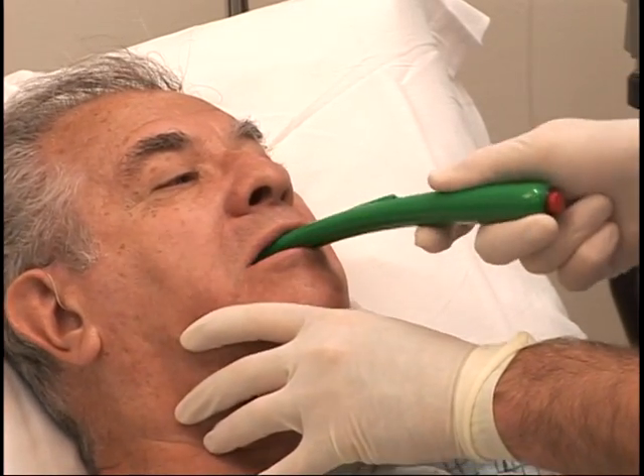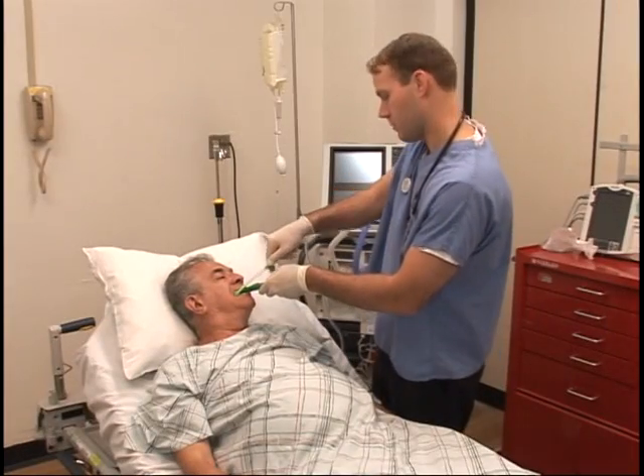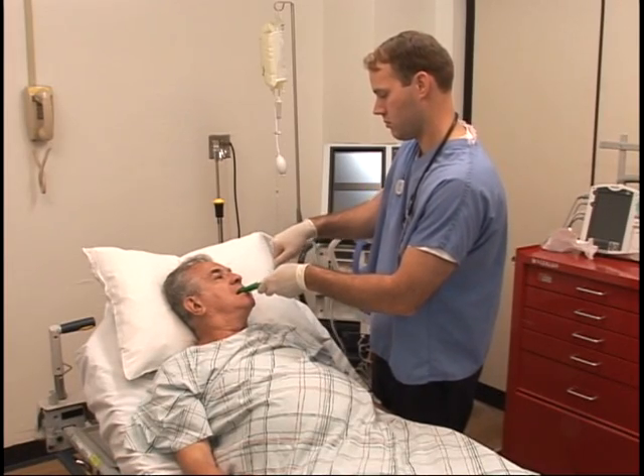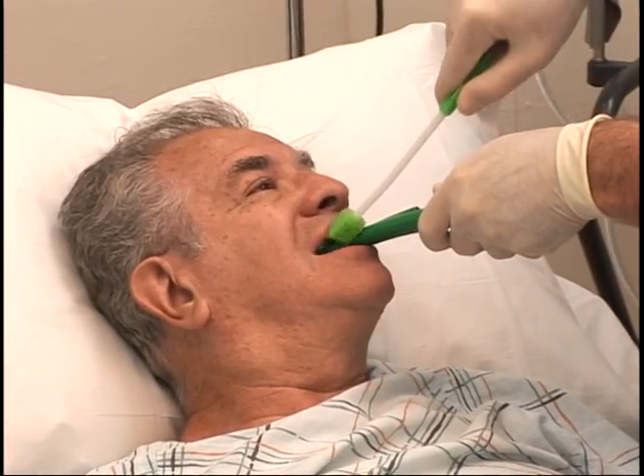Turn on the light for oral assessment. Begin oral cleaning and oral suctioning. If the patient bites down, they will bite down on the No-Bite 5 and not your oral care devices, allowing you to safely perform your duties.